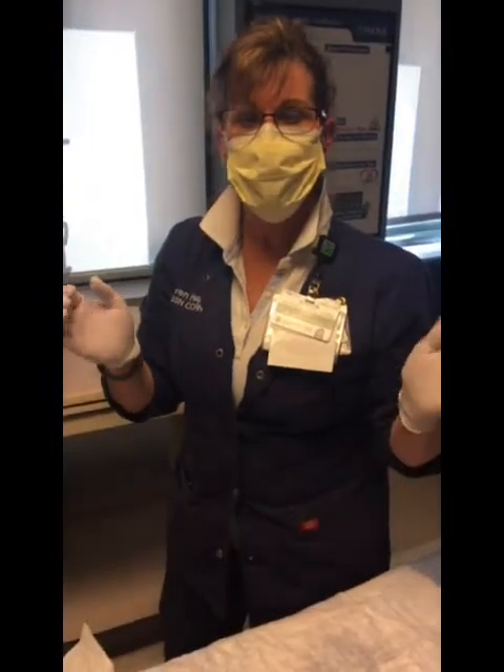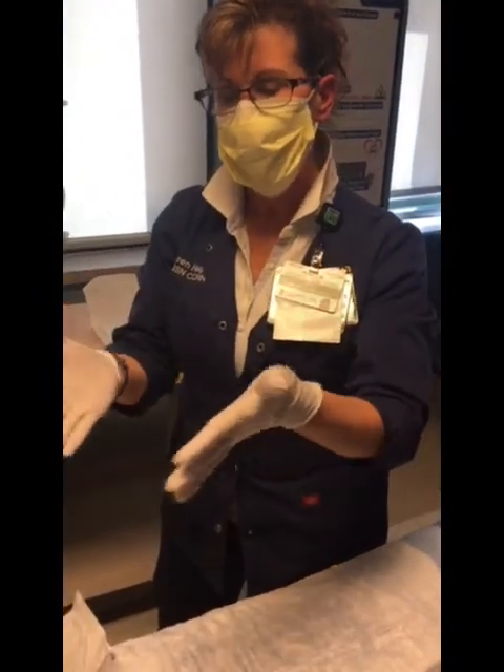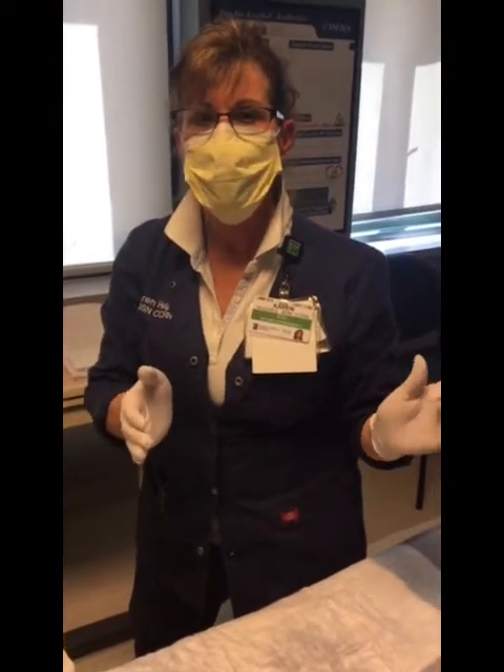The masks do not have to be worn during the entire procedure — it's just for the starting and stopping. But most of the time I spend all my time in here, so it's just easier to keep the mask on. The mask goes on you as well as the patient, and if there are any other family members in the room, they also need to wear a mask.